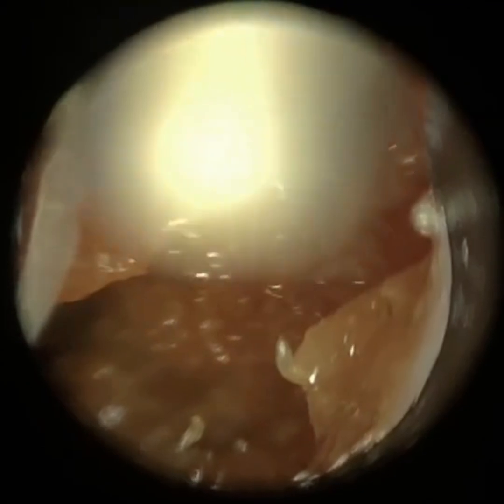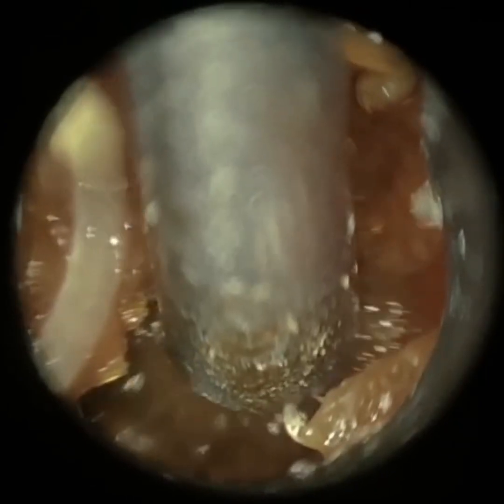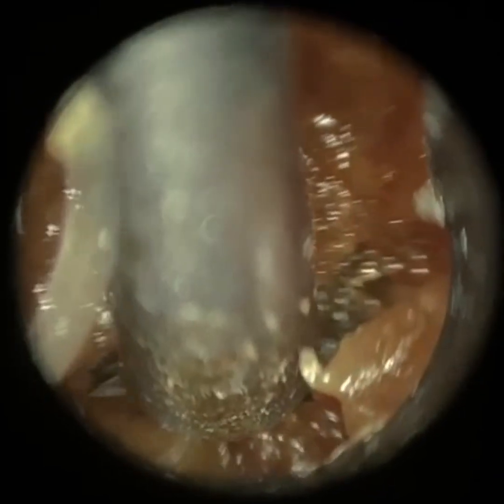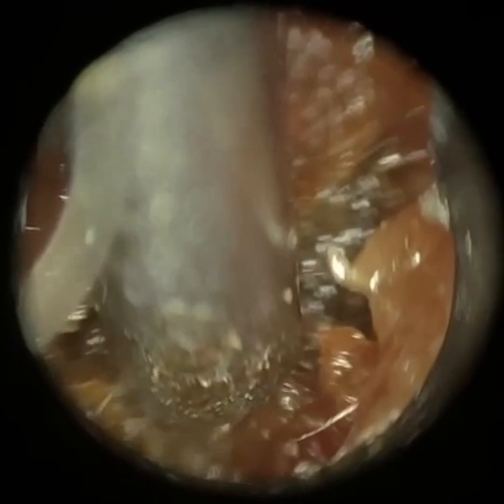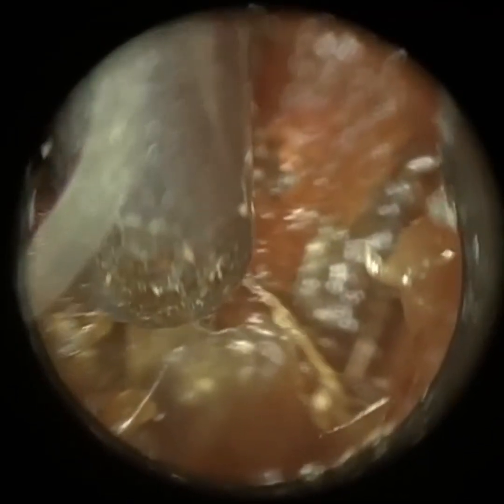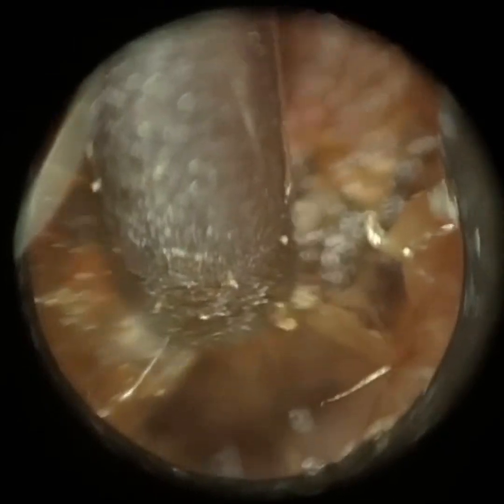This procedure is actually not performed by myself. It's performed by a colleague of mine, a very young, aspiring, and very talented audiologist by the name of Maxwell Vokes, who works for his family-run business, Correct Hearing in Nottingham. Max was one of the first specialists to get trained using the Waxscope earlier this year, and his progression has been outstanding. He's forever forwarding me videos for advice.